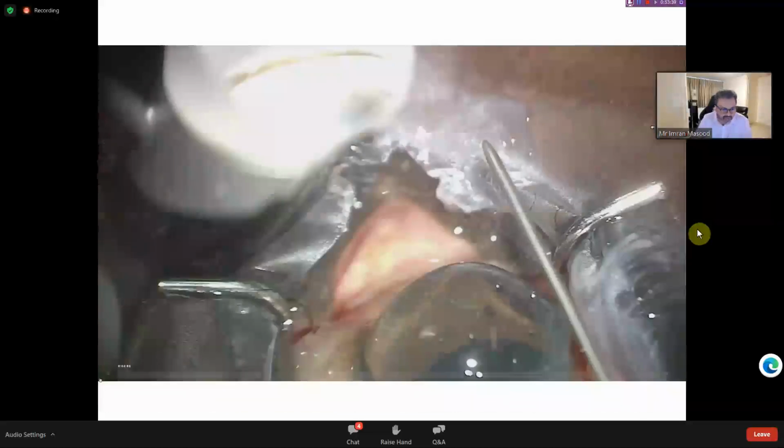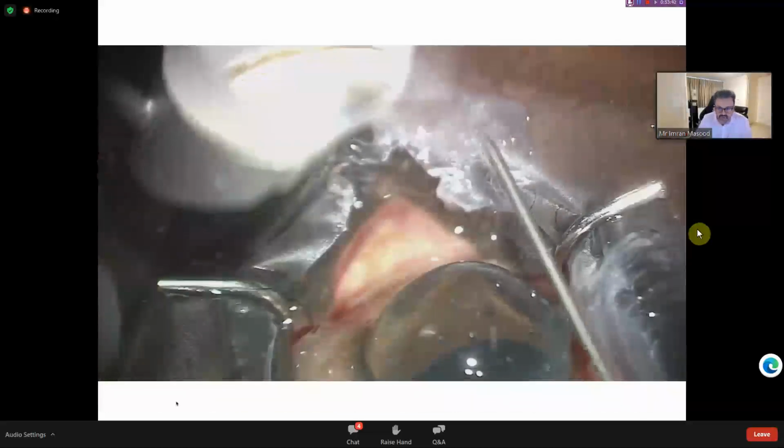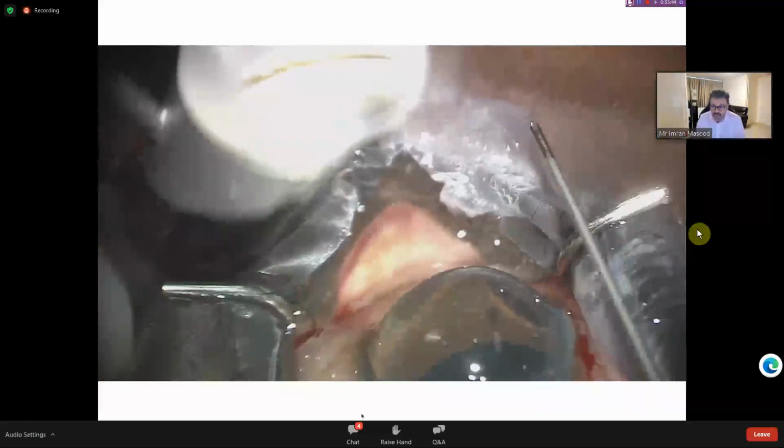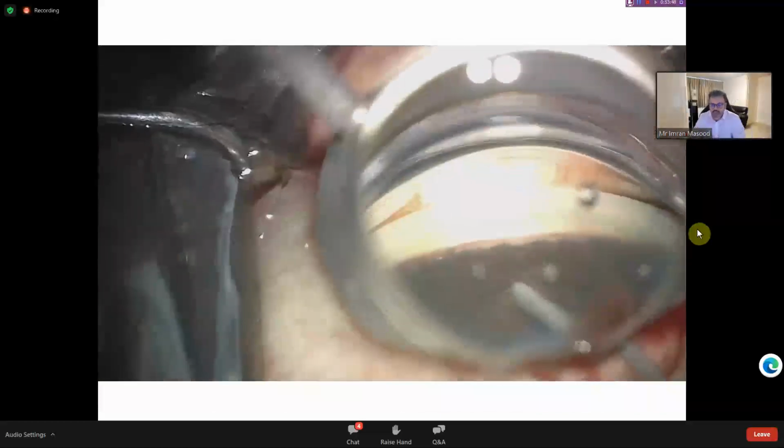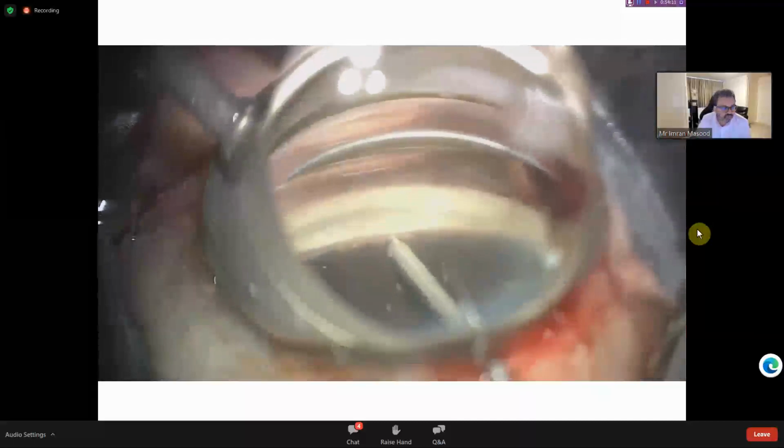Okay, so let me show you some examples of the iStent inject W. This is an Afro-Caribbean patient with previous trabeculectomy and advanced glaucoma, who was undergoing cataract surgery on 3 medications. So this is showing you the W. You can see the flange is a little bit wider there. Again, we're getting reflux through the inlet of the stent. We moved a couple of clock hours across, and then we pop that in there. And again, let's have a look at the episcleral flushing.